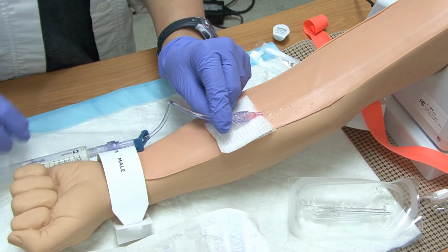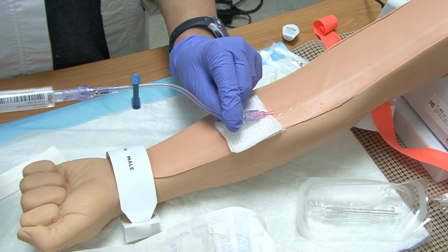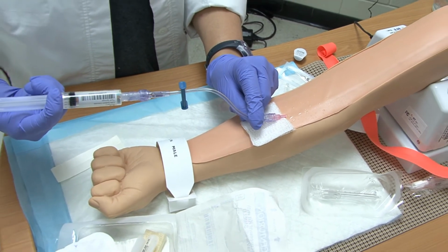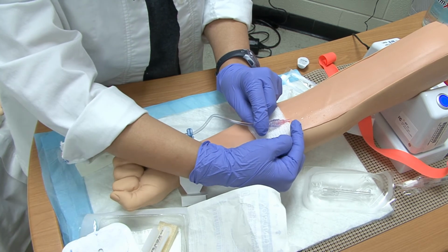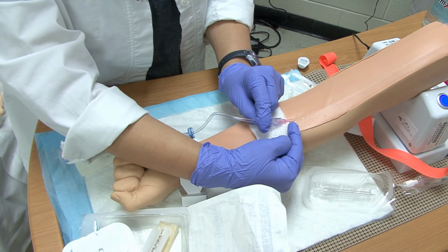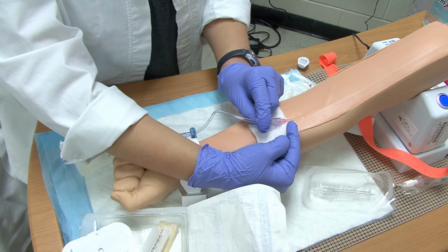I'm also going to make sure I keep my sharp in view. Once I'm ready, I'm now going to flush this. And as I flush, I actually look to see if I've got swelling or if the patient complains of any pain up here at the site. If you have swelling, then you probably do not have a patent IV.